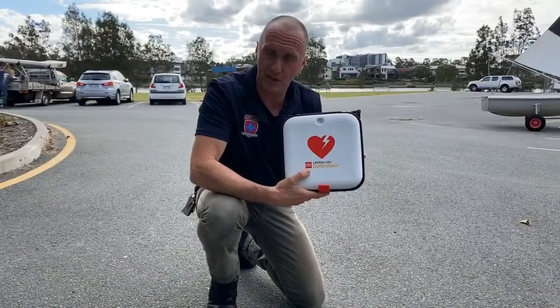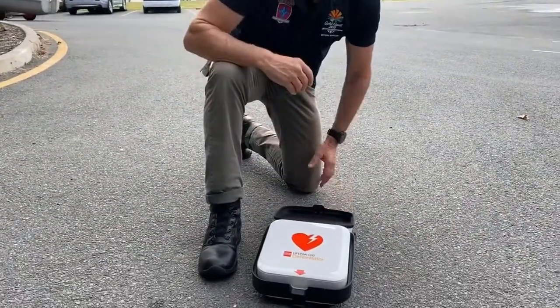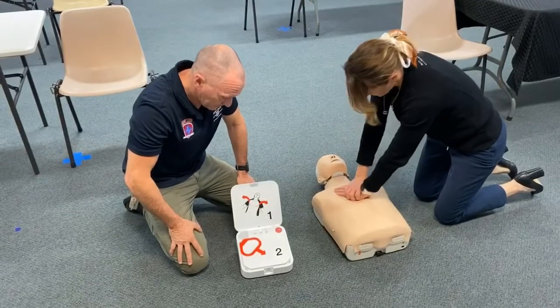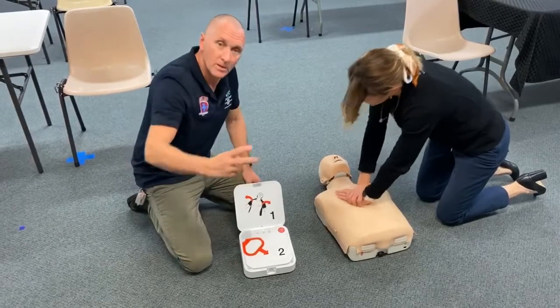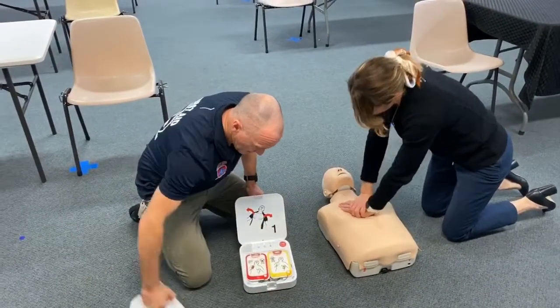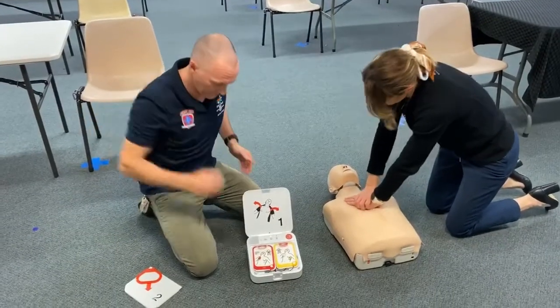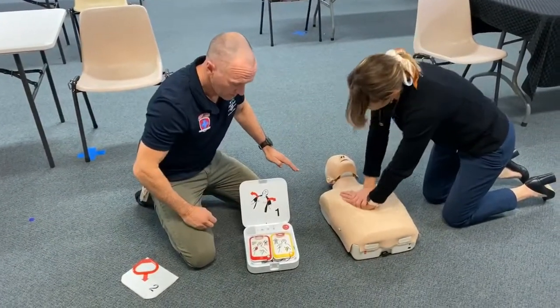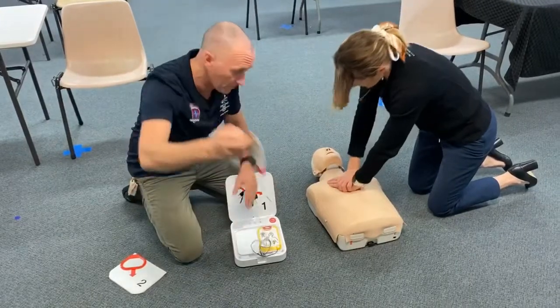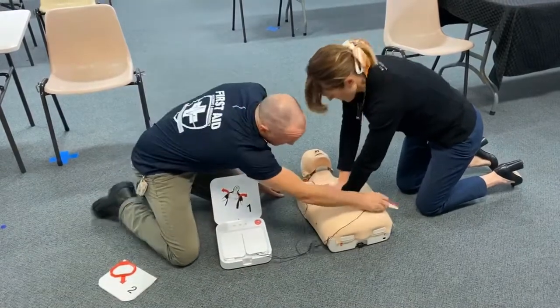When you put this CR2 defibrillator on your patient, quite simply open up the device — once you open the lid it starts to work. Adult mode. Remove all clothing from the patient's chest using the shears. Pull the red handle to reveal the pads. Look at the pictures on the pads — driver's seat belt position. Apply pads to bare skin exactly as shown in the pictures. Continue CPR while the defibrillator is being applied — apply one pad at a time, take it off and put it on.